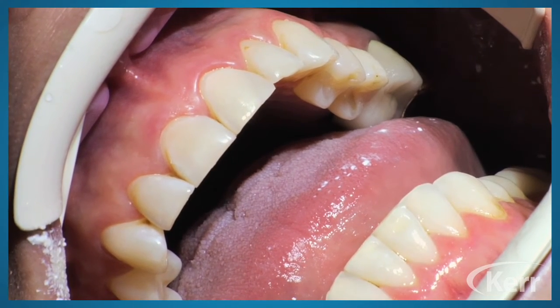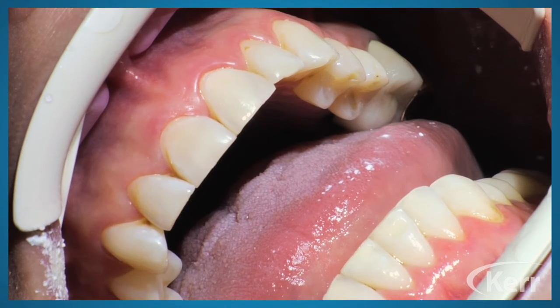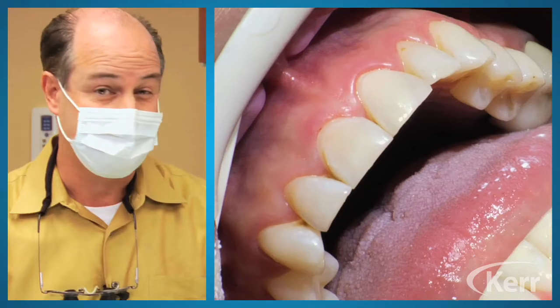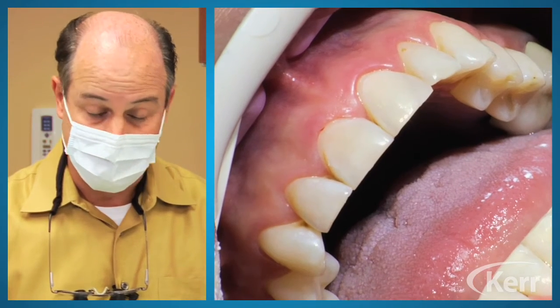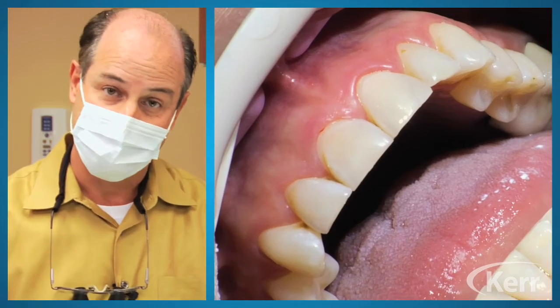As you saw, I used 2 here. Probably could have got away with 1, honestly, but I'm a little fussy sometimes. I hope that you like a nice polish. You saw I only used a yellow striped diamond initially, just to get a little bit of contour. And then I went to one medium disc on the facial, and then one fine disc, and that you saw had a nice polish.